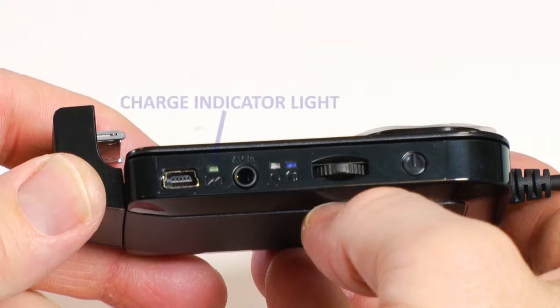This is the charge indicator light. A steady green light means a full charge. Blinking green indicates a nearly full charge. Amber indicates power running low, and red indicates the charge is nearly depleted.